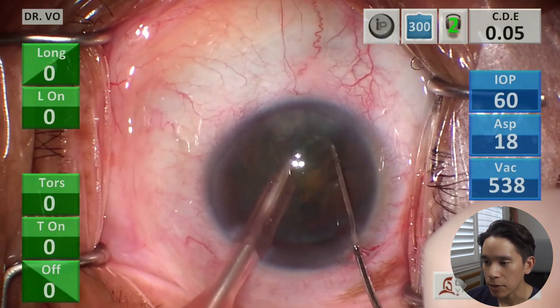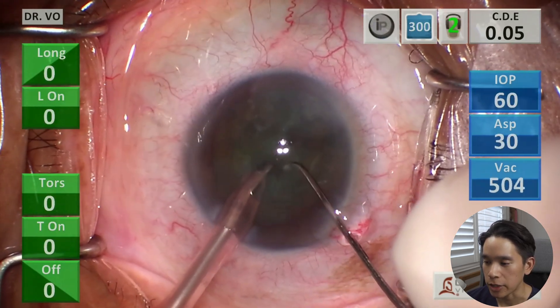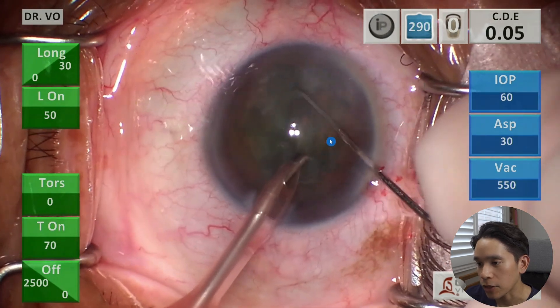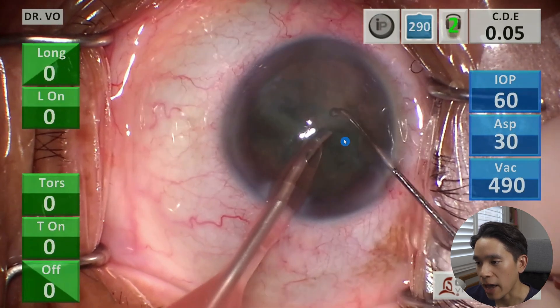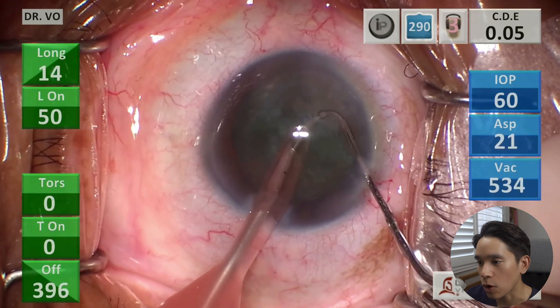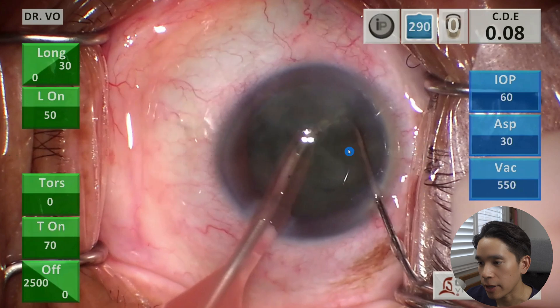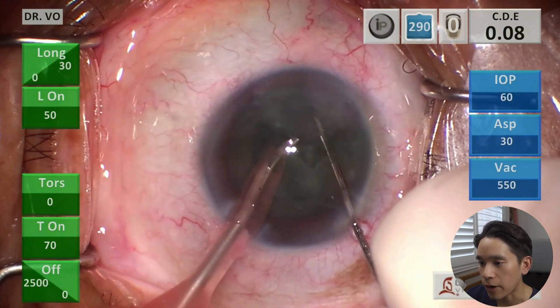When we remove the cataract, typically most surgeons will break up the cataract into four quadrants and then suction out each quadrant. So here I just made the first two halves — that was the first crack in the cataract. Now I'm going to crack one of the halves into two quadrants, and then go ahead and suction up each quadrant individually. That's the second crack there, and then we'll suction out each quadrant and work on the final half.